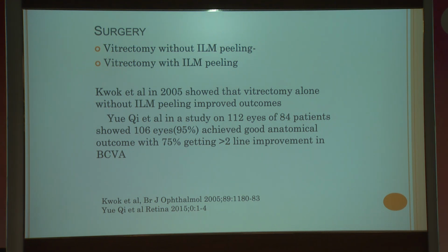I know that in the recent newsletter of the VRSI, Barbara Parolini said, I don't peel ILM in foveoschisis. Actually, I have not been doing peeling of ILM, so I just want to share some of the cases that I've done. Kwok has also shown that vitrectomy alone without ILM peeling improves outcomes in these patients.